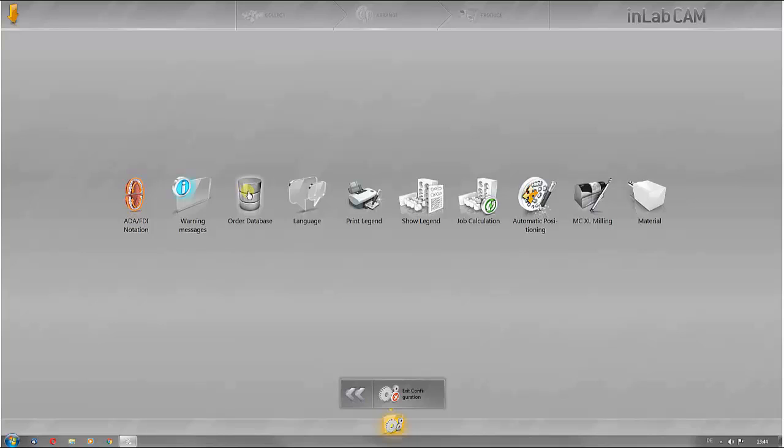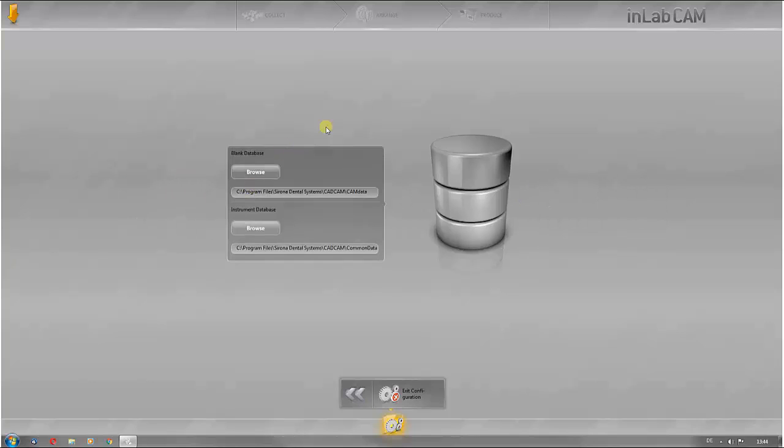You can determine the storage location of the CAM software blank database at any time under folder database. Please note that you must also select this database in the InLab software.